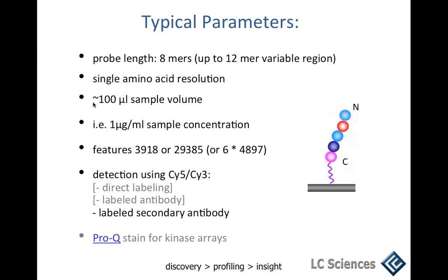If you are having serum samples, typically we would dilute the serum 1 to 1,000 and see what type of data we're getting with that. And if this is too weak, doesn't show enough binding, then we would go ahead and run on the same chip a dilution of 1 to 100. And if this is still too weak, then we would dilute it 1 to 10. Typically, the best results so far we are getting with 1 to 100 dilution with serum.